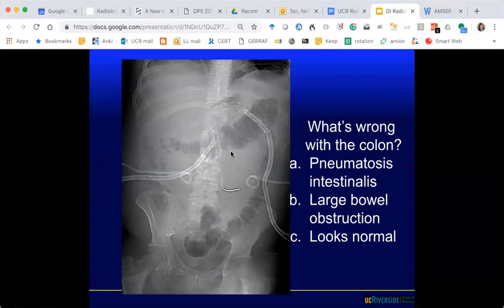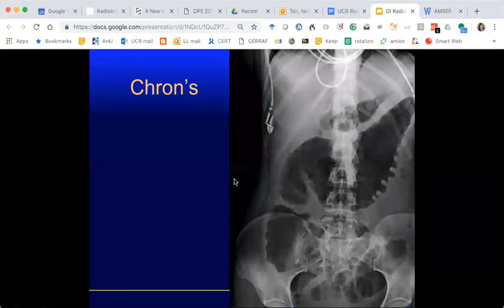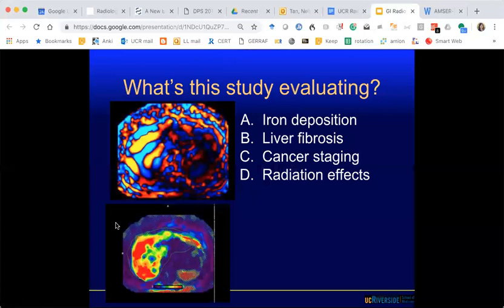A patient with a history of Crohn's presents with abdominal pain. This is the radiograph — a KUB, which stands for kidney, ureter, bladder. What's wrong with this image? The colon is dilated — possibly from toxic megacolon.